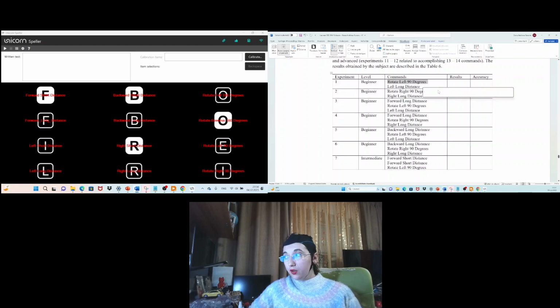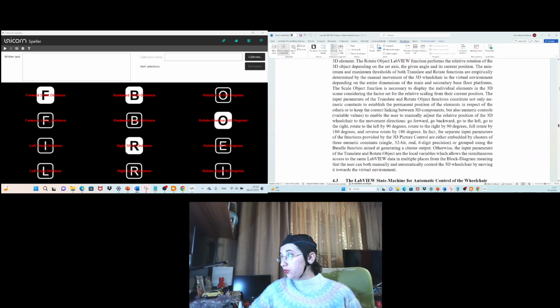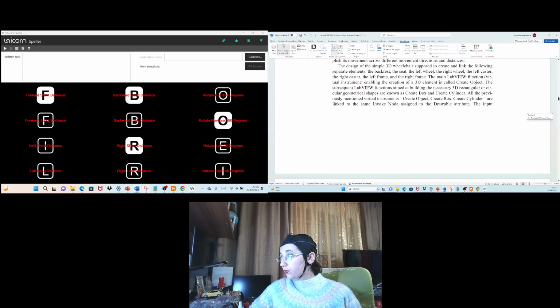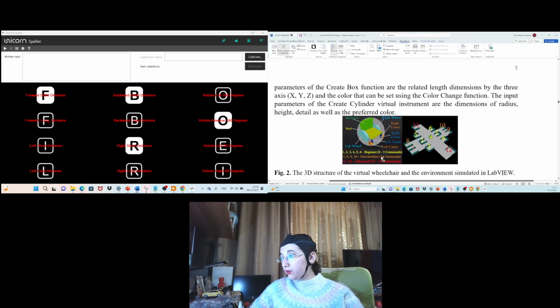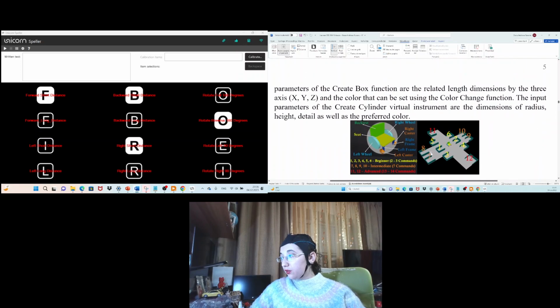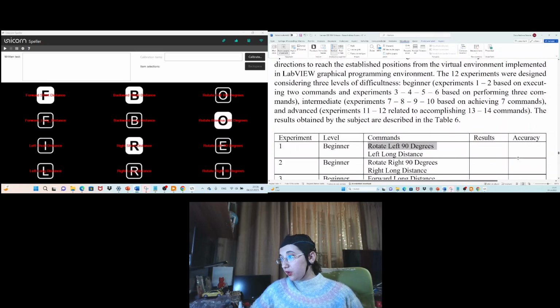So here we need to reach this. I will show you also the locations. So here are the destinations, the final destinations that the 3D wheelchair should be controlled to. Here is the first destination, then second, third, fourth, fifth, sixth, and so on, 7, 8, 9, 10, 11, and 12. And let's check again the commands.